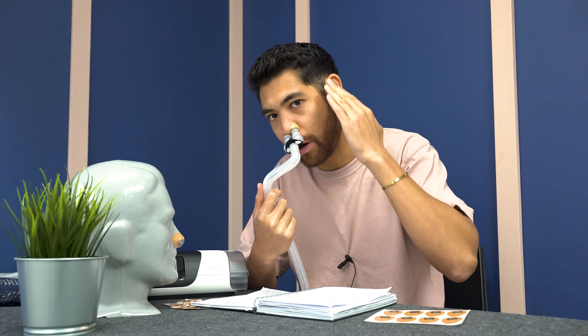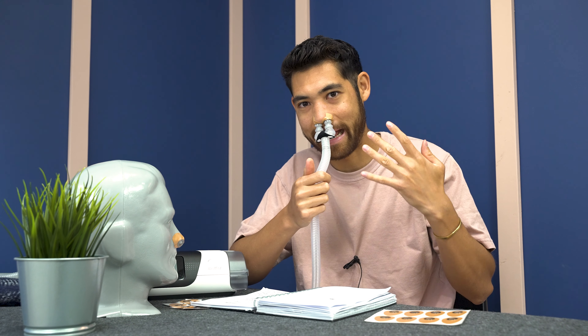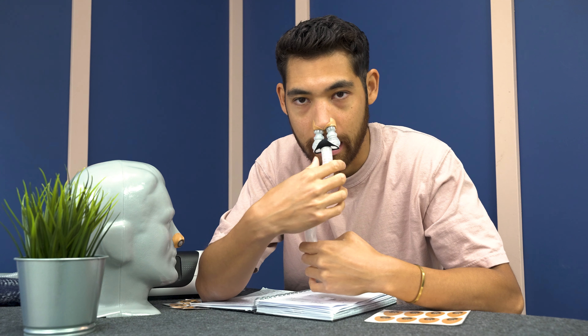You don't need any headgear, no red marks, no messing up the hair. These magnets are super strong so they don't come off in the night. And most importantly, you're not going to get any leaks.